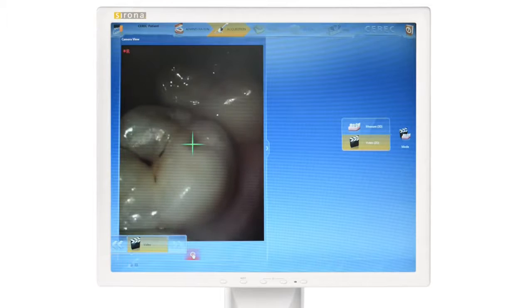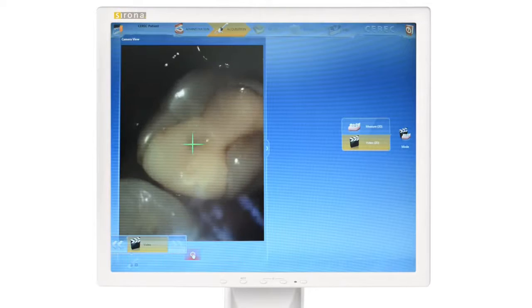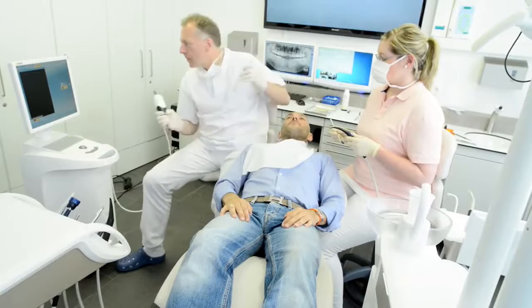We'll start with the patient counseling mode, available only with Omnicam. Using the full-color camera, a video of the situation can be made and used for patient education and clinical security. Once the patient accepts the case plan, treatment can begin.